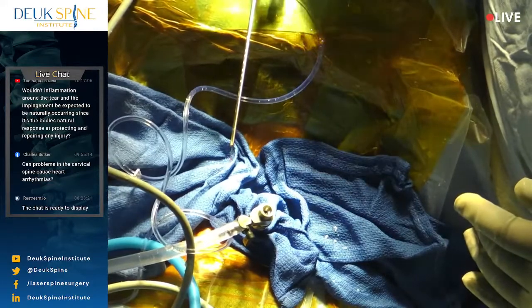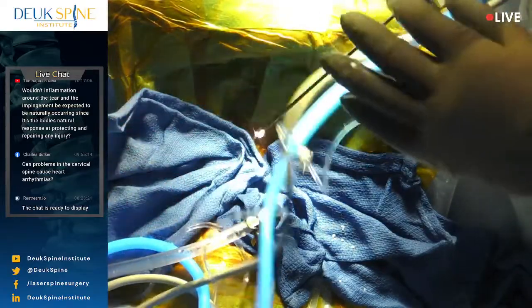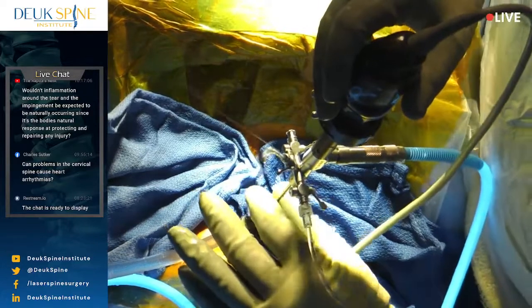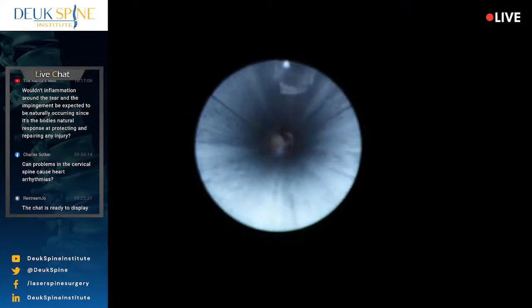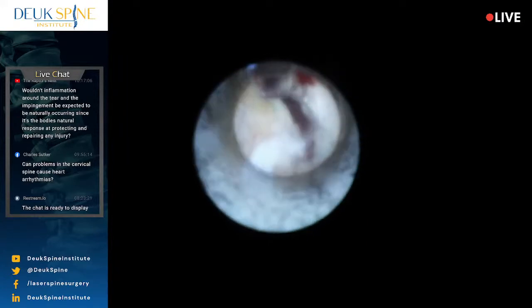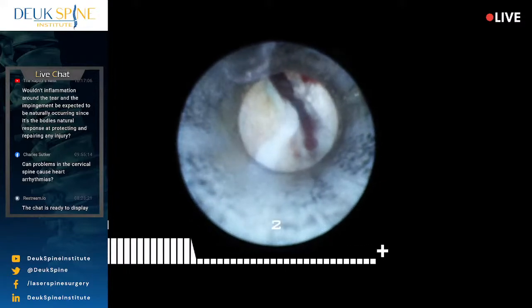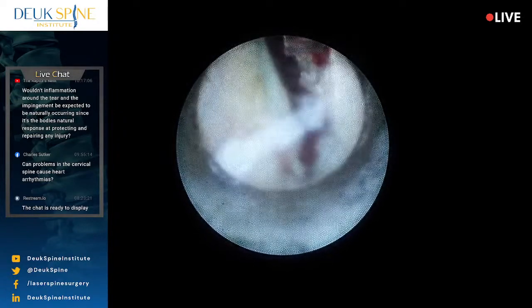What, the scope? Yeah. All righty. Lights on, please. Thank you. Let's see what we got down here. Let's bring this fiber. Better? It is better. Awesome. I think part of my problem is I'm zoomed. I need to zoom in a little bit. No, that's the brightness. There's the zoom. So I'm gonna adjust the focus just a little bit, see if I can make it better.